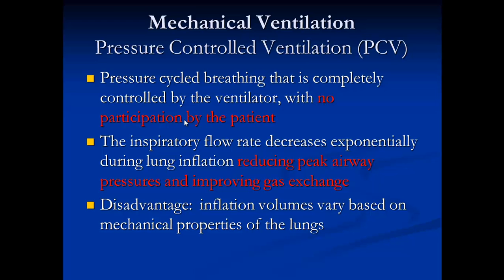The inspiratory flow rate decreases exponentially during lung inflation, reducing the peak airway pressure and improving gas exchange. Disadvantage for this pressure control is basically based on mechanical properties of the lung. Patients could have volutrauma and barotrauma.